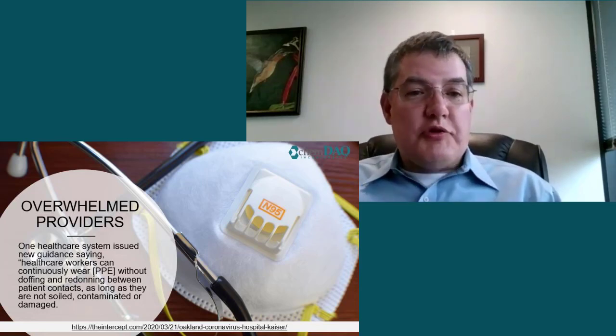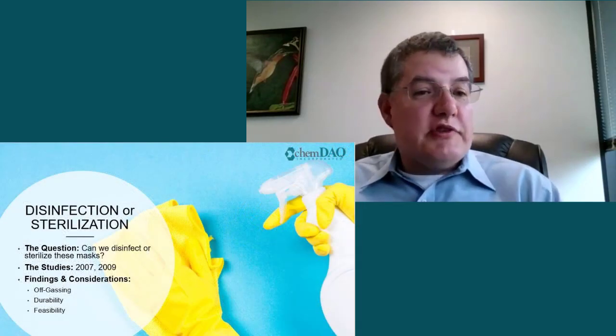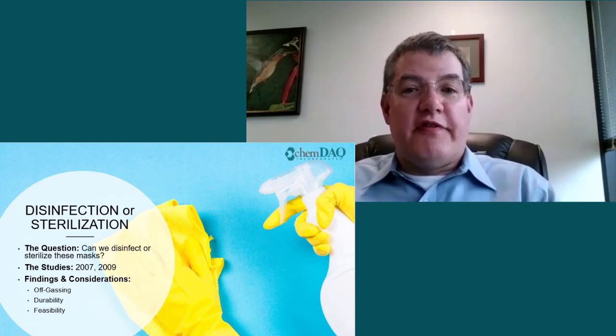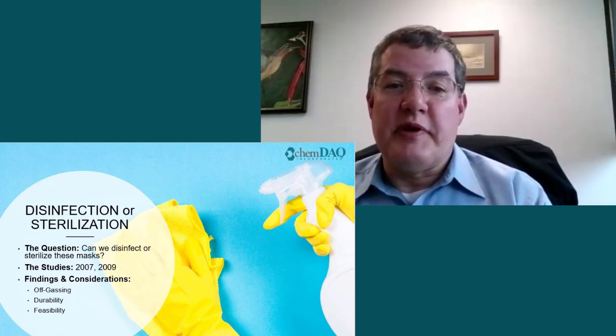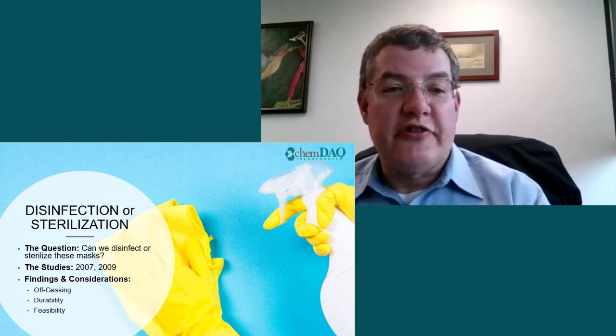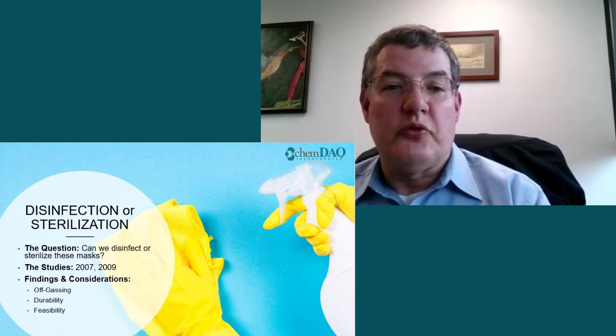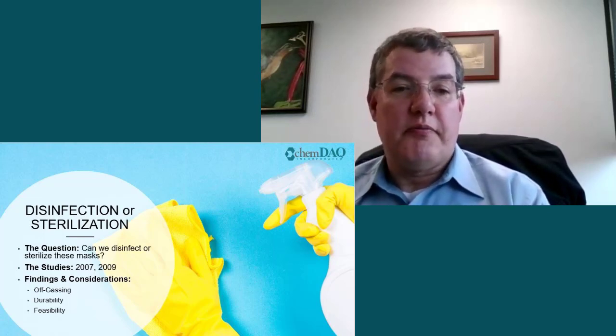N95s, as I'm sure everyone listening knows, are single-use devices. But the question is now raised, can they be disinfected or sterilized? This is not the first time that this question has been asked, since there have been pandemics in the past, such as the SARS coronavirus in 2002 and the H1N1 swine flu in 2009.